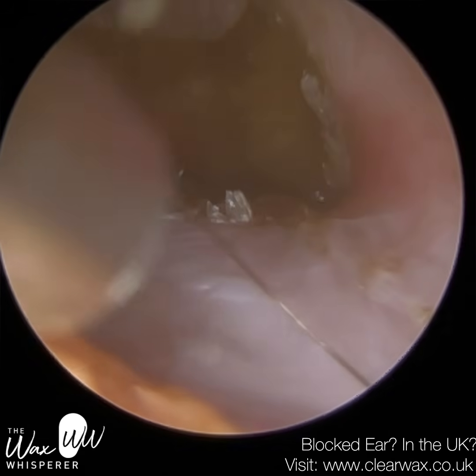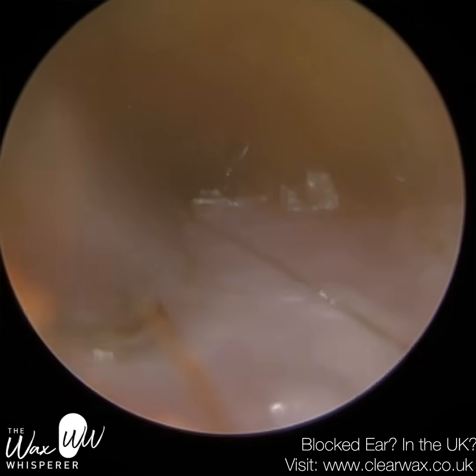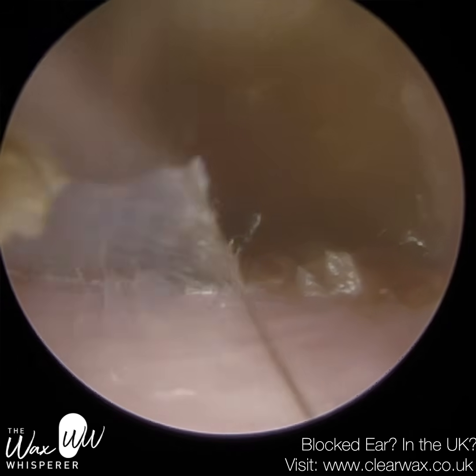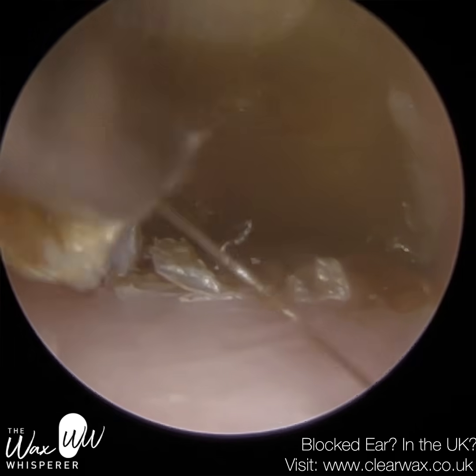So by wearing custom ear defenders, it's attenuating loud sounds and reducing the effect of the Tullio phenomenon. But when you've got custom ear defenders, it can introduce sweat and humidity in the ear, which can also contribute to all this skin that I'm peeling away. So what's superior semicircular canal dehiscence?